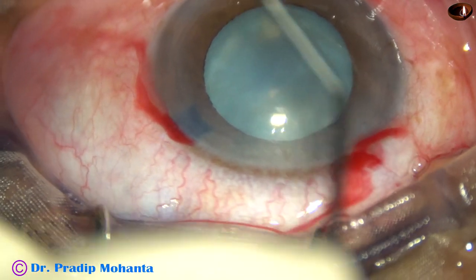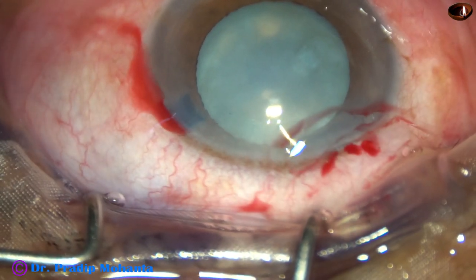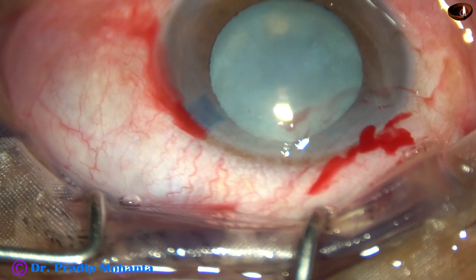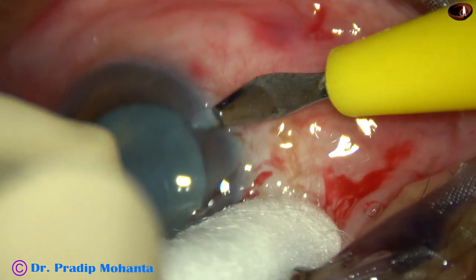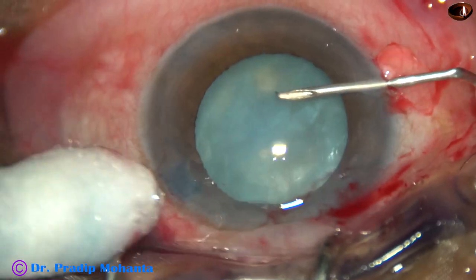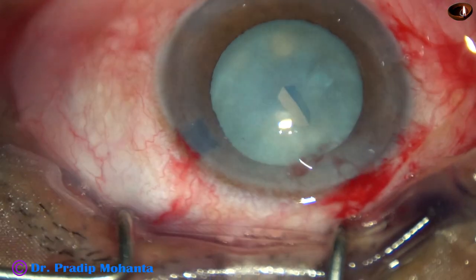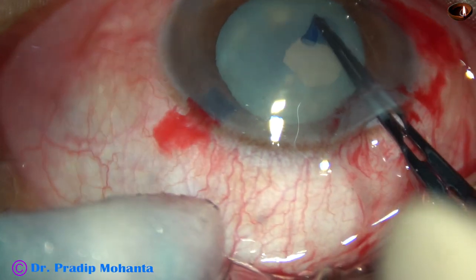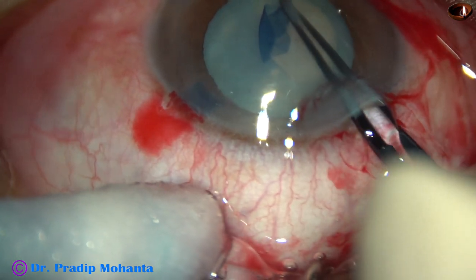And now, this is 2% hydroxypropylmethylcellulose. The cataract appears intumescent, but let us see what happens as we incise the anterior capsule. Here goes a bent needle. As we incise the anterior capsule, nothing comes out. So this is not an intumescent cataract — this is a non-intumescent mature white cataract.